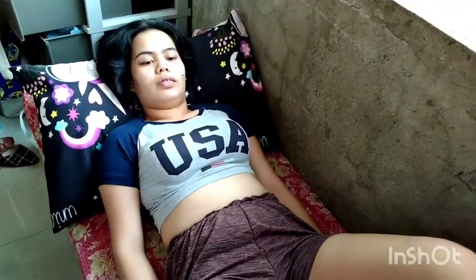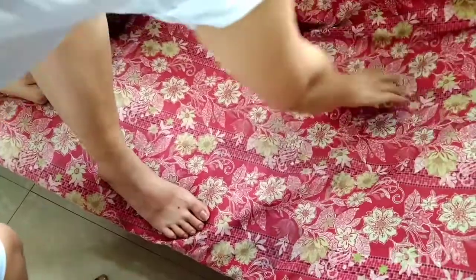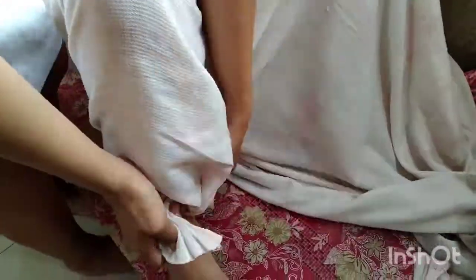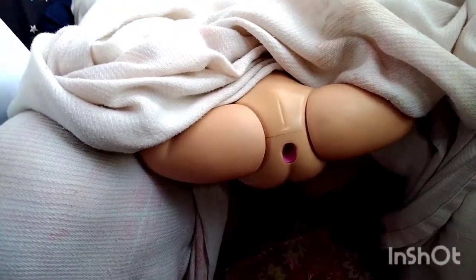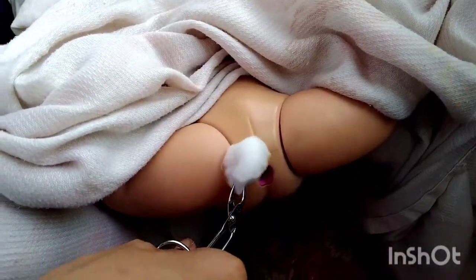After draping the patient, assist the patient to side near you. After that, loosen foot part of the top sheet. Next step is to use the diagonal draping. This helps expose perineum and avoid unnecessary exposure of body parts and maintain client's comfort. Next step is to provide perineal care if needed. Presence of microorganisms near urethral meatus is reduced.